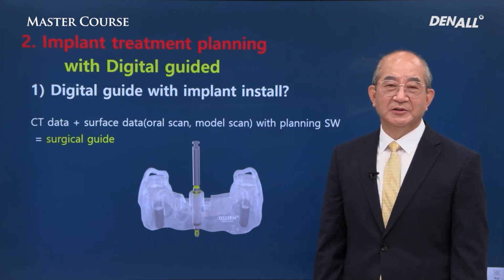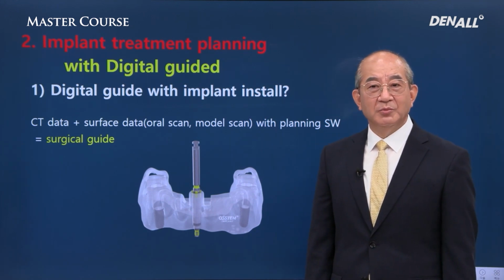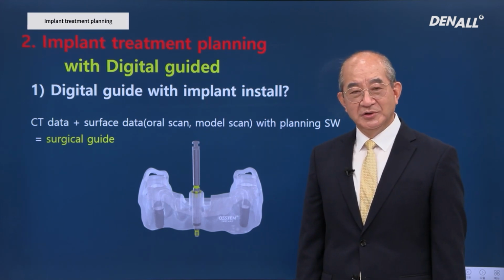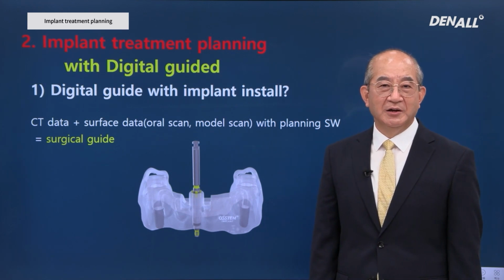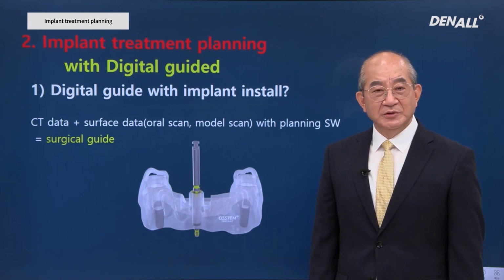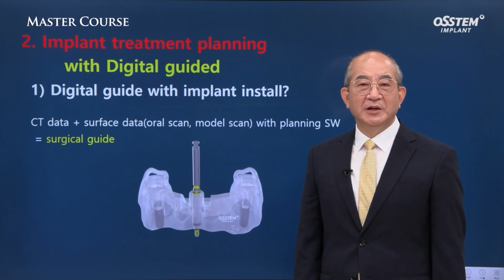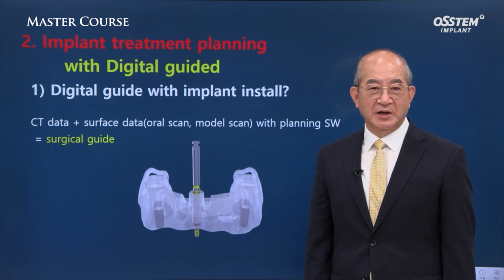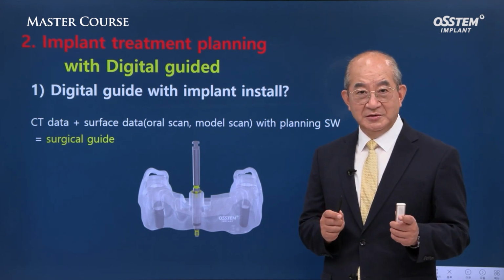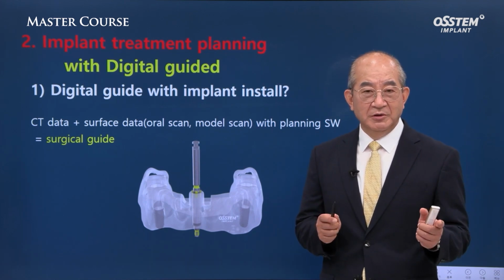This was quite a tedious job, and if fixatives or developers got on the gown, it would change color and it would look nasty. This was cause of Monday blues to many hygienists and the staffs working in the dental clinics. For dentists, what was most uncomfortable was the lack of space to maintain the X-ray. These days, we take digital images, so there's no need for film and you can see it immediately. You do not need to develop the film.